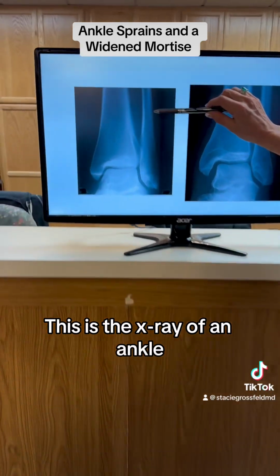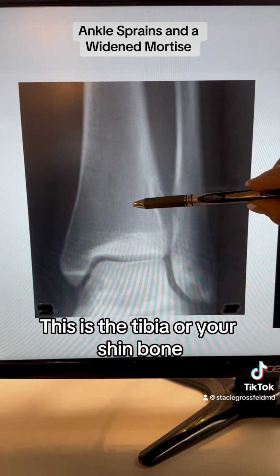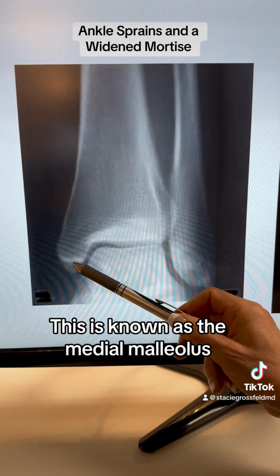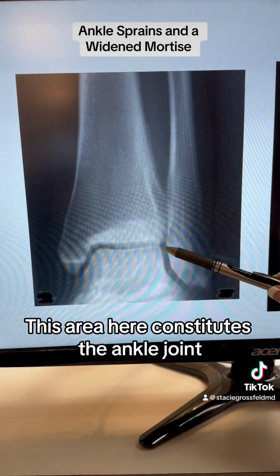This is the x-ray of an ankle. This is the fibula bone right here. This is the tibia or your shin bone. It's the lower part of your tibia. This is known as the medial malleolus. This area here constitutes the ankle joint.